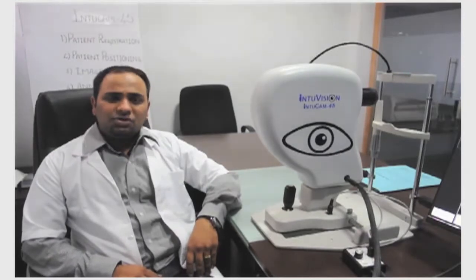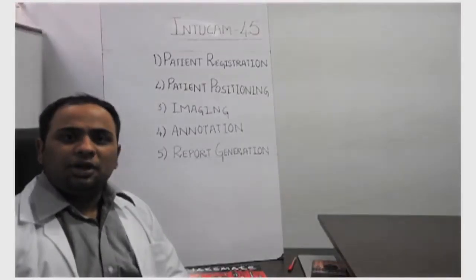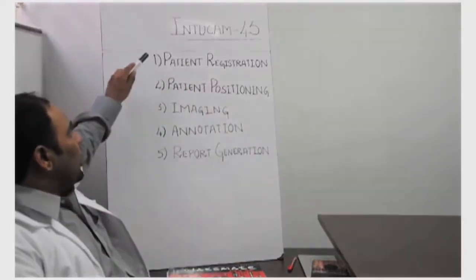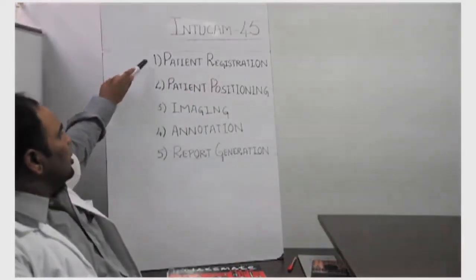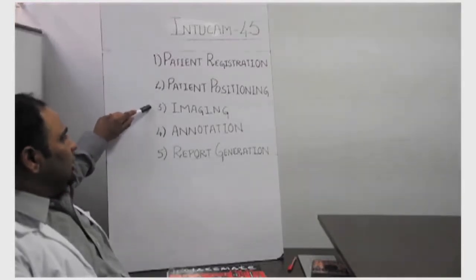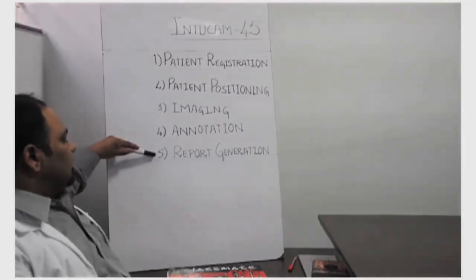Today we will demonstrate how to do retinal imaging using IntuCAM 45. Retinal imaging in IntuCAM 45 is a 5-step procedure. Number 1, patient registration, followed by patient positioning, then live imaging. We move on to annotations after that, and finally report generation.